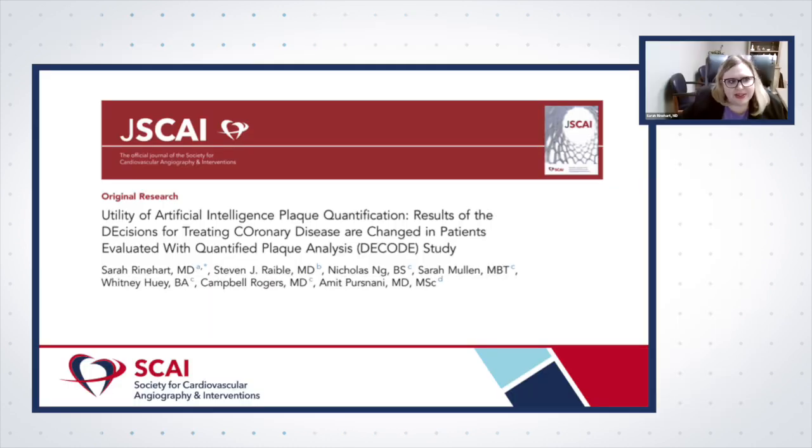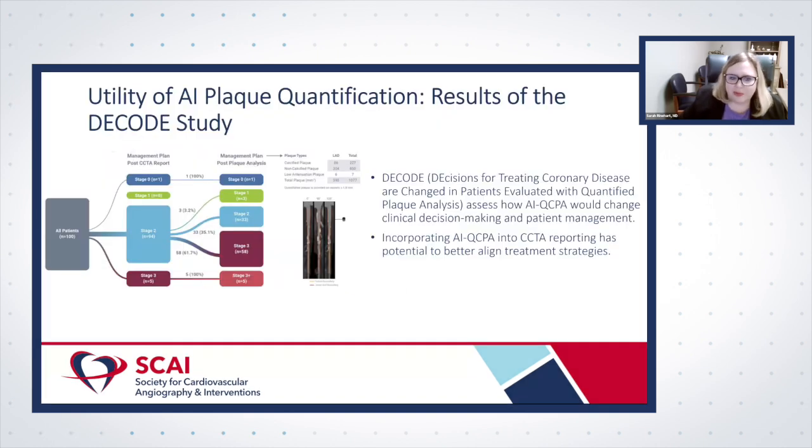So I think this is an exciting study because plaque analysis on coronary CT is now becoming clinically feasible because of all of the advances in artificial intelligence. And the question, though, was, we know the value of looking at the plaque analysis. We know that plaque burden is associated with events, but we really haven't looked in a strategic way as to, are we going to change medical therapy based on these plaque volumes? Are we going to intensify therapy?